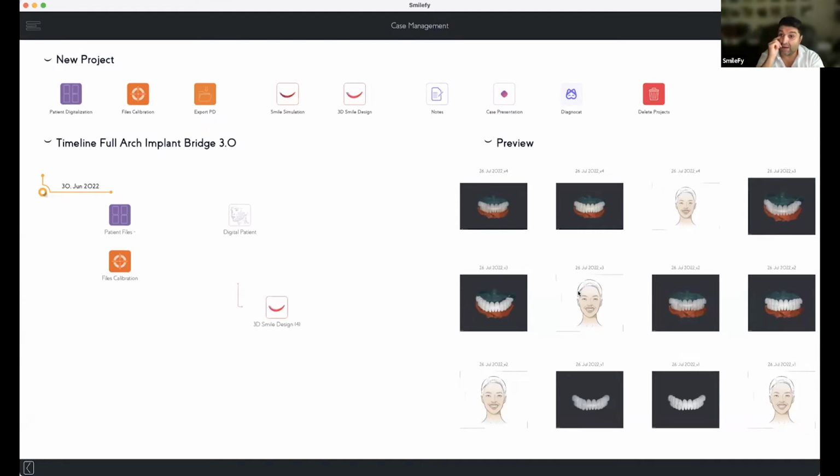Now we do have some testing with a company from China called Shining 3D, and they just made a very good facial scanner in which the mouth area is not distorted. I'm very excited to see the final product, because the lip, the round lip, the teeth, are not distorted at all.